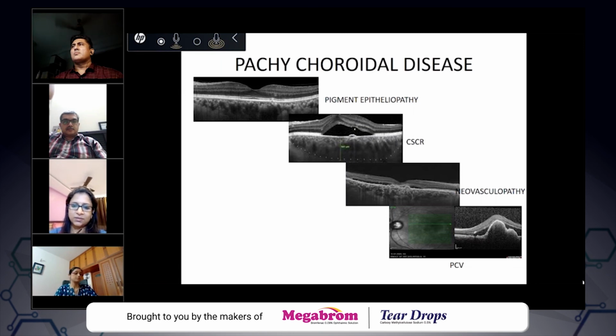In monitoring the response and follow-up, we will generally use OCT alone. Okay, sir. Unless you see a recurrence, then you will probably again do an angiogram. Otherwise, only OCT.